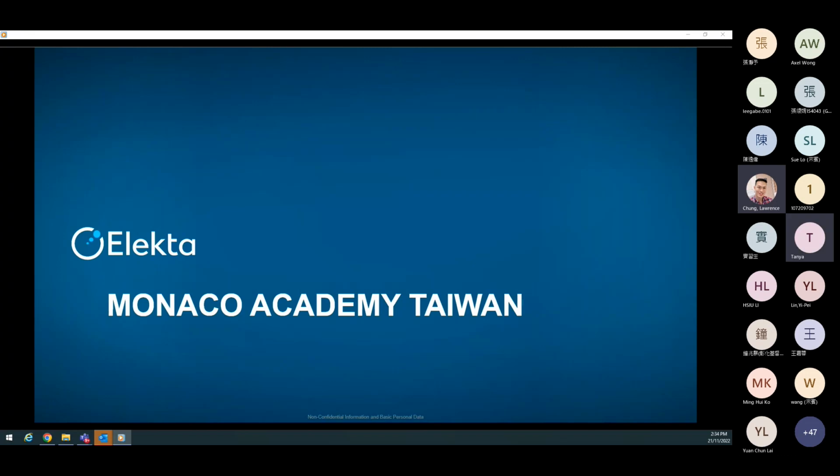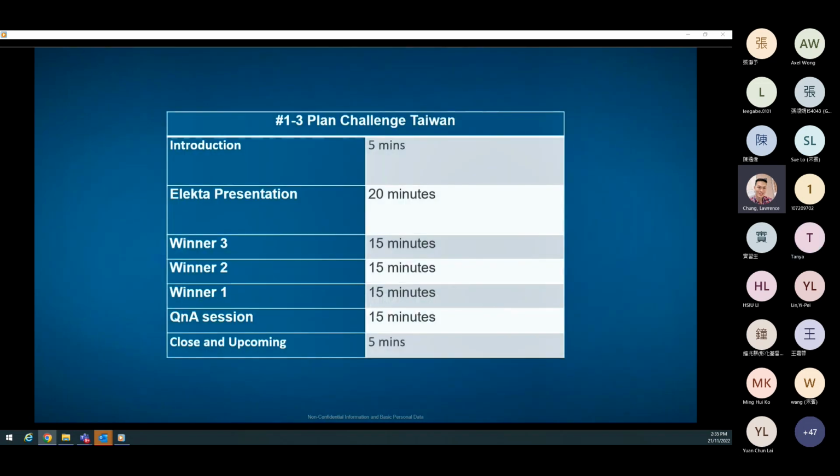Hi, everyone. So again, my name's Wim Starbuck, and I'm going to be talking through the Monaco Academy that we're going to be hosting for Taiwan, and really outline the reasons why we're doing it, the reasons why it's going to be really beneficial to our users. It also provides a great opportunity for sharing best practice and really learning how to improve the overall planning skills that we have in a really fun, interactive environment.